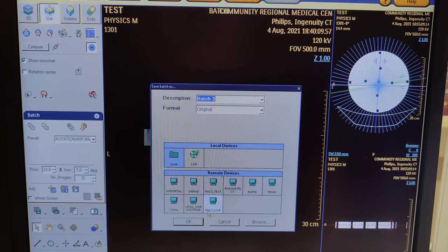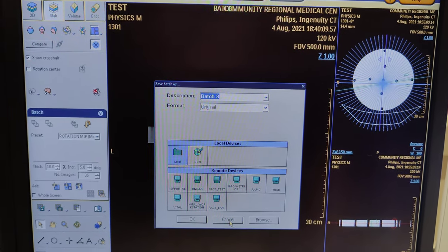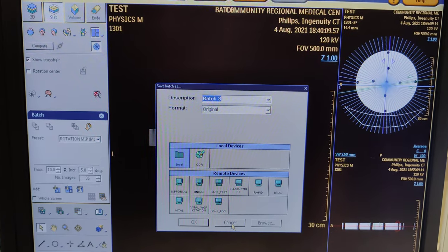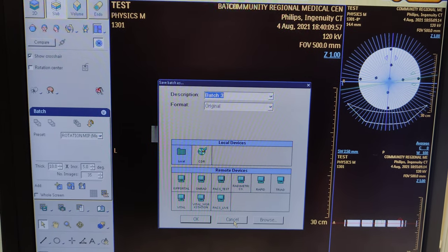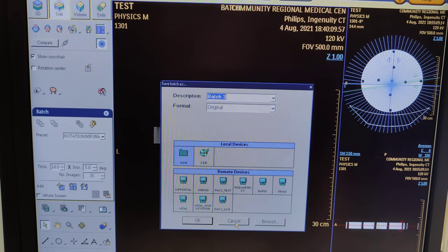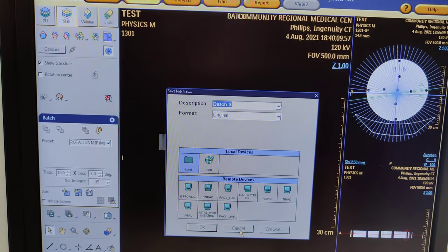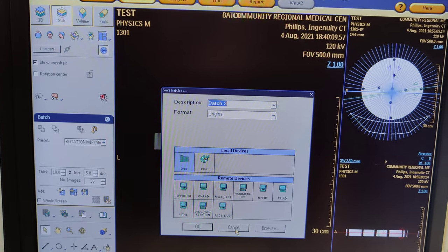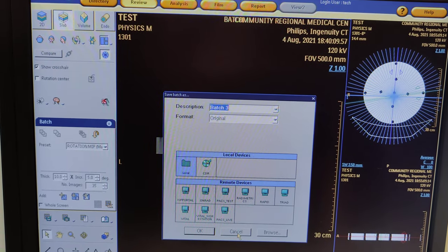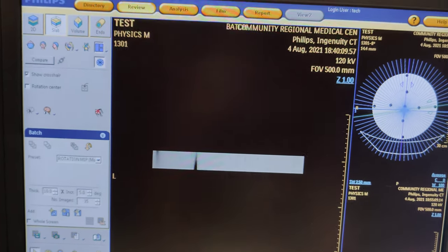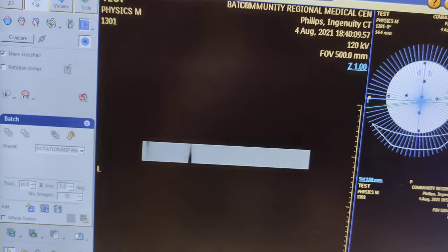It's going to be your rotational MIP. Save, and that's it. Then send everything else. That's how you do a CT pulmonary reconstruction after you've scanned it.